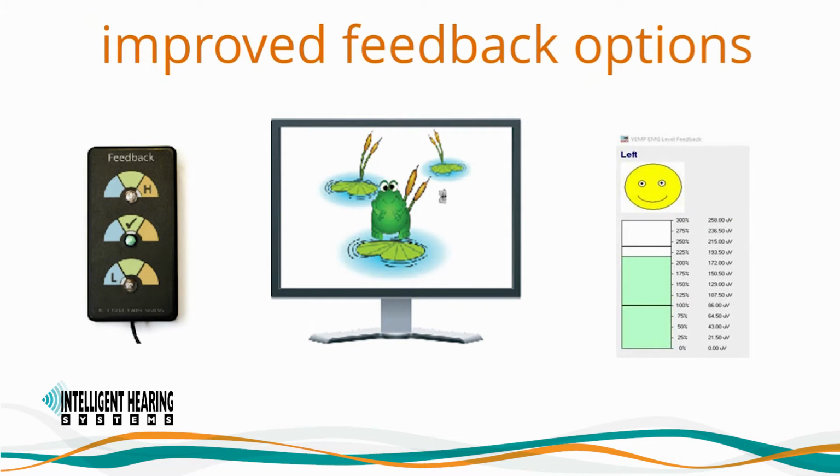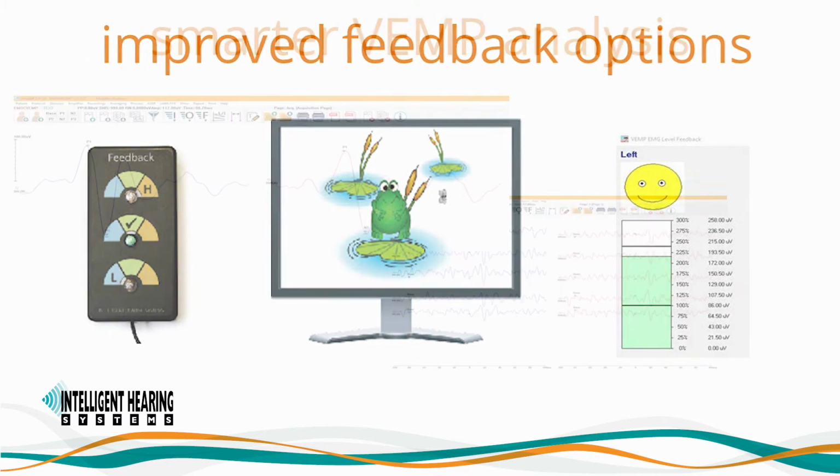SmartVEMP provides various patient-friendly options for visual biofeedback. First, the feedback box with LED indicators, with the green LED turning on when the EMG activity is adequate, and the orange lights turning on when the EMG activity is too low or too high. We also have the on-screen EMG level display with a happy and sad face. Happy face, of course, when the EMG activity is adequate, and the sad face when it is not. For pediatric testing, we're happy to include an option for animated videos, which play when the EMG activity is adequate and pause when it is not.